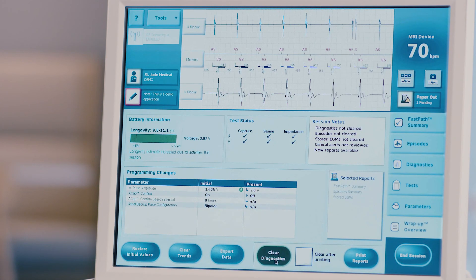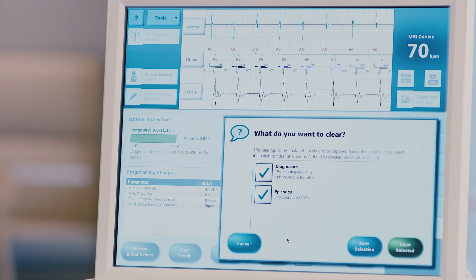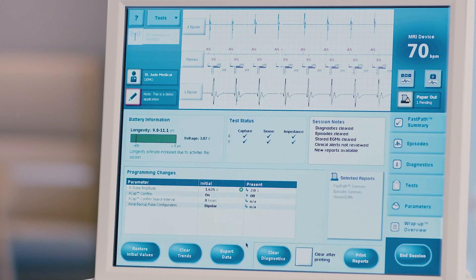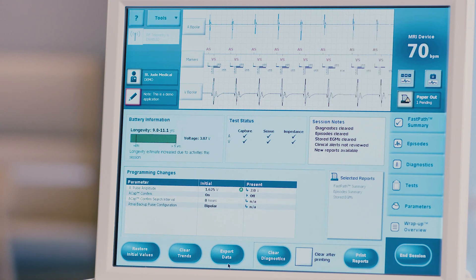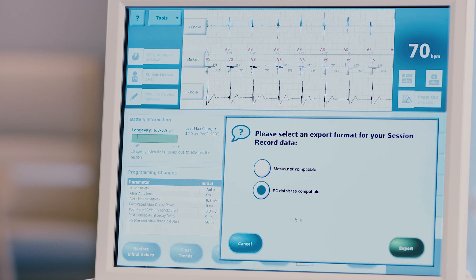Press the green clear diagnostics button to clear device diagnostics and stored episodes. The what do you want to clear screen will appear. Check the appropriate boxes to permanently clear information from the device. Press the green clear selected button. If you need to export reports for EMR uploading, press the export button at the lower right of the screen. For most EMR software, you will need to choose the PC database export option.